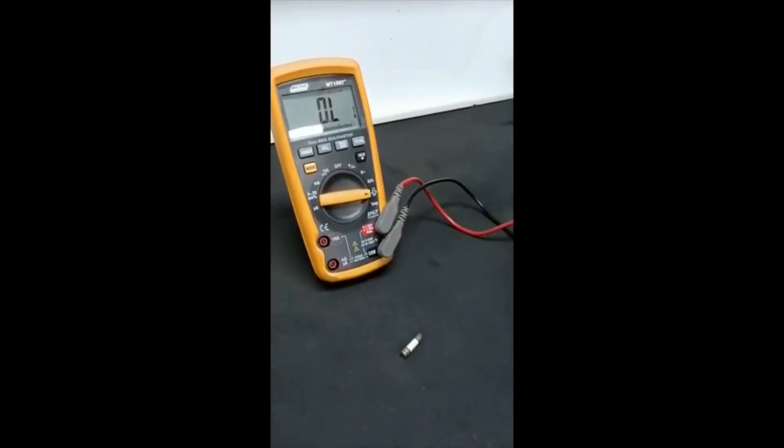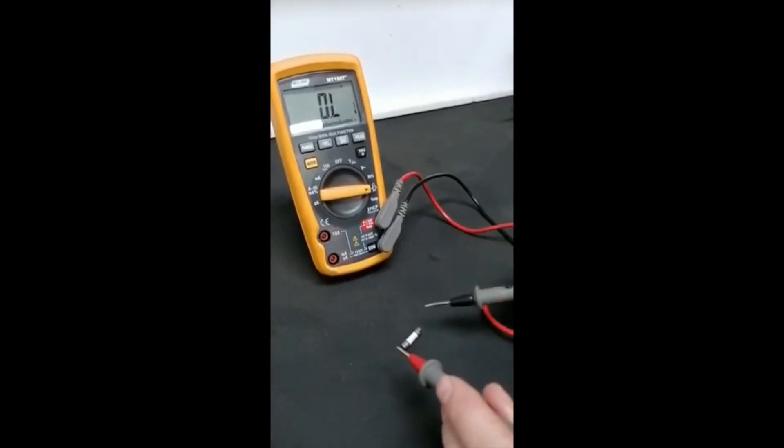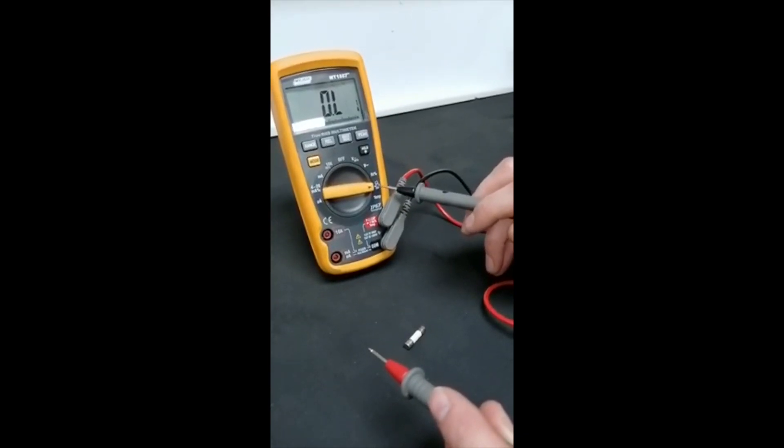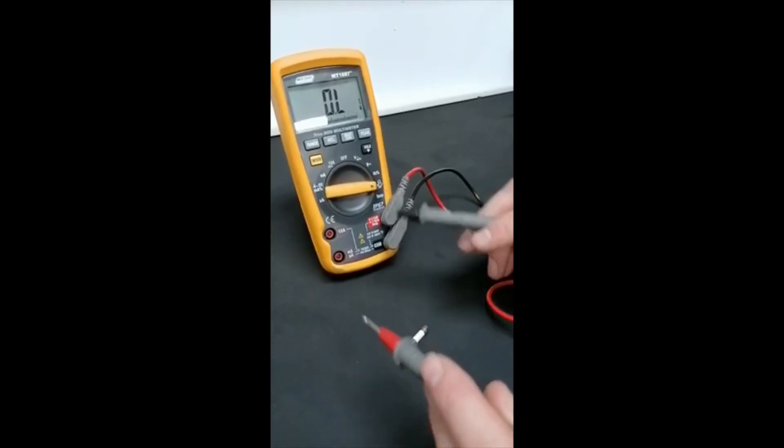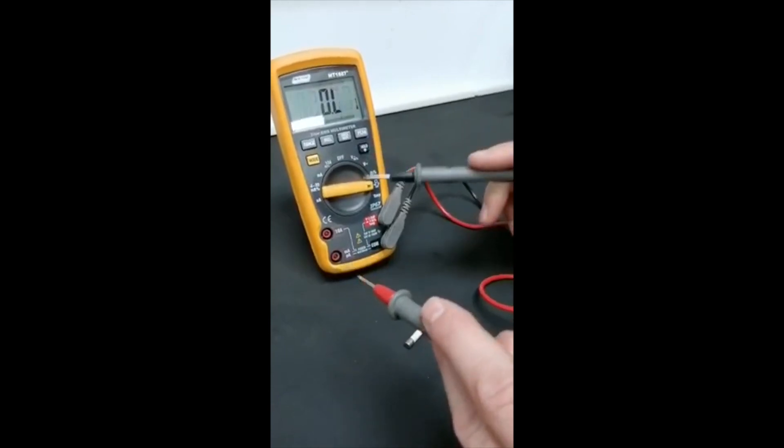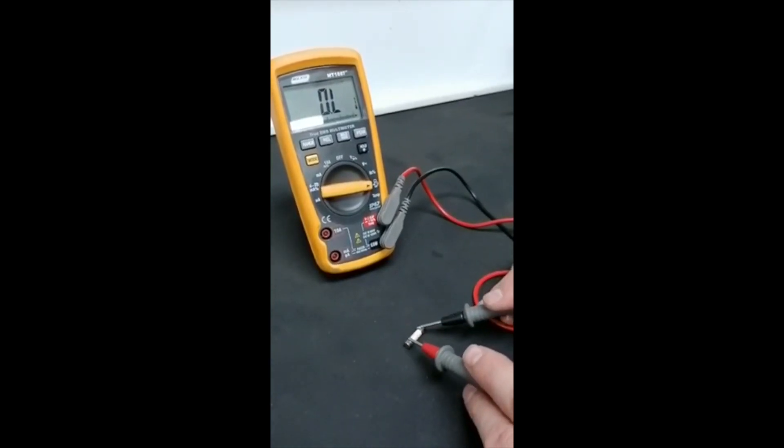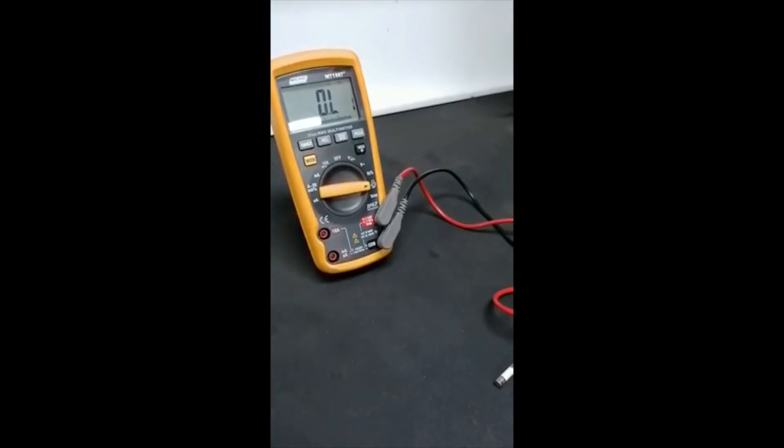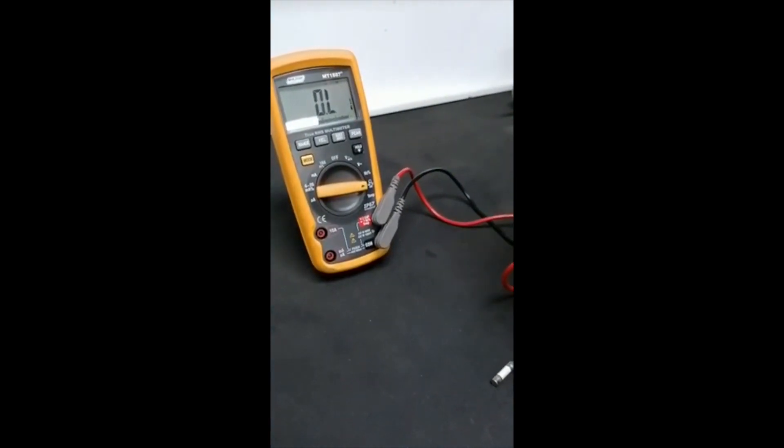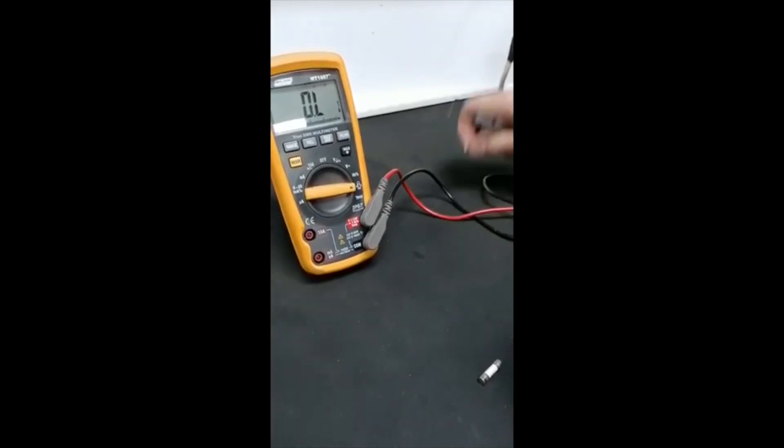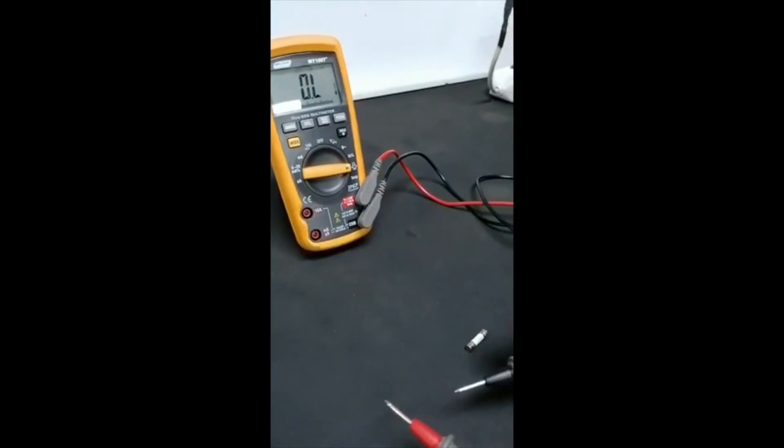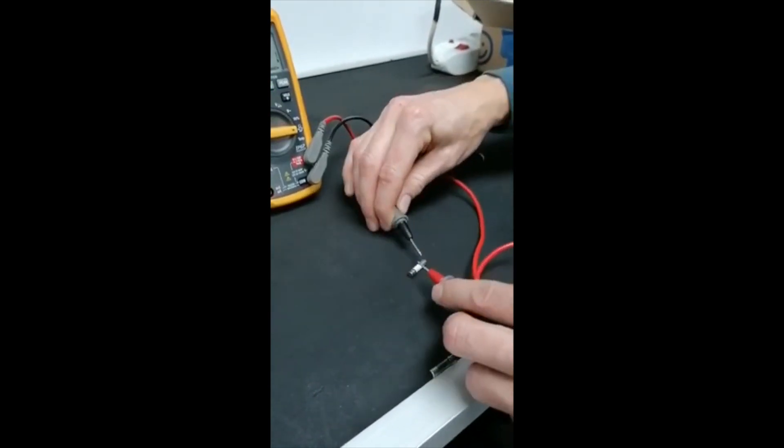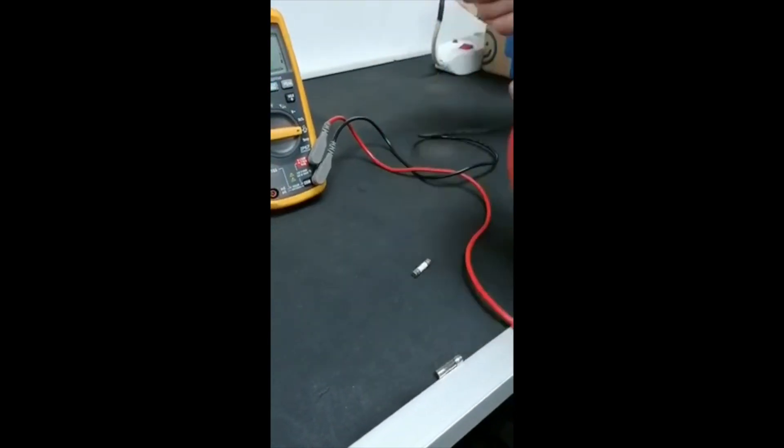I'm just going to do a continuity test on a fuse. You would see there, there's ohms and diode test and a little speaker. So you would put it on there, if you put the two testers together, it beeps. So this fuse is working, I'll get a beep. This will be an example of a broken fuse, no beep.